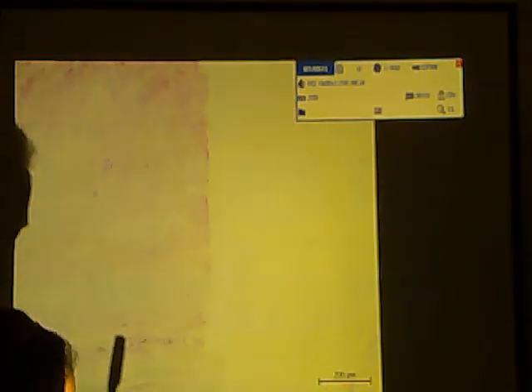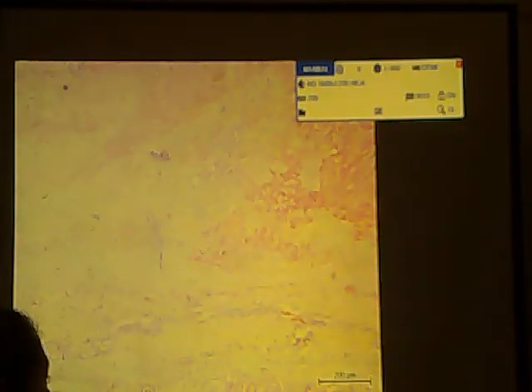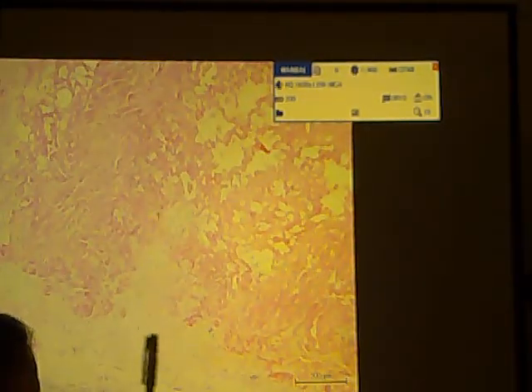Acute inflammation, basically you will see neutrophils. If it's chronic, you will see most likely lymphocytes, predominantly lymphocytes. So this is acute fibrinous pericarditis, also known as bread and butter pericarditis.